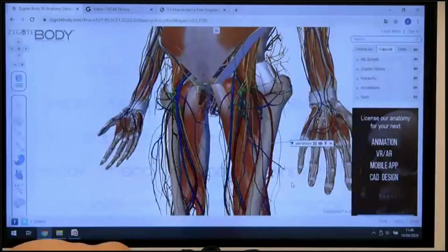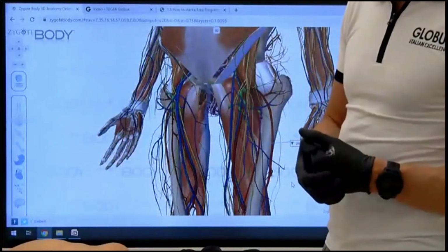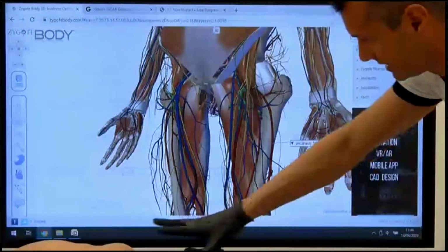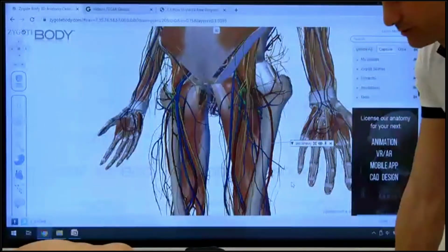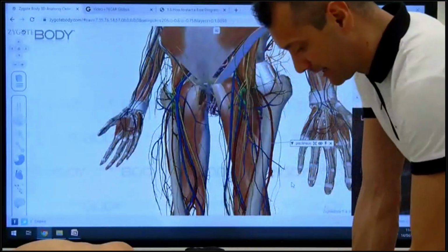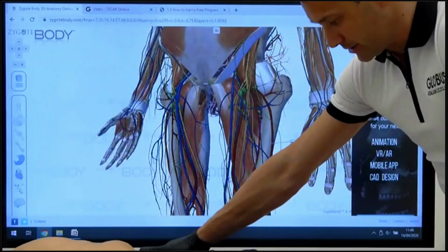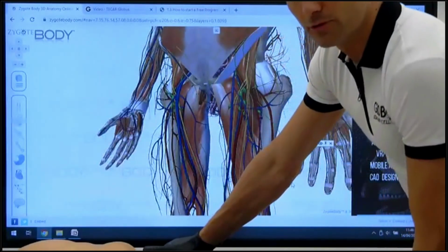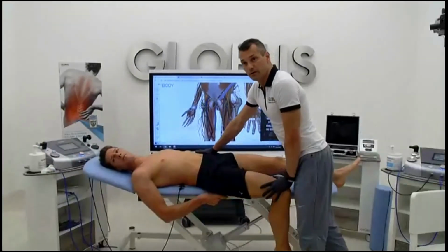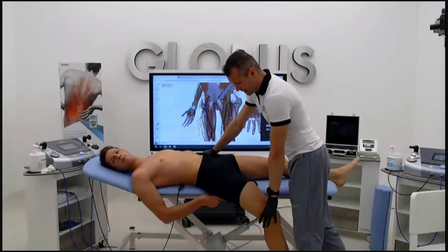So when we're talking about hip problems, we need to focus not just on the hip muscles but on the whole chain, and also with exercises, and the automatic, hands-free treatment can help us a lot. For example, pushing the plate over here and the electrode on this part and doing some exercise, pushing upward, release, like PNF, push up, and release completely. And then relax, a complete relax.